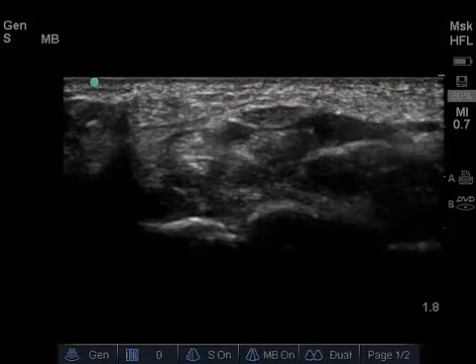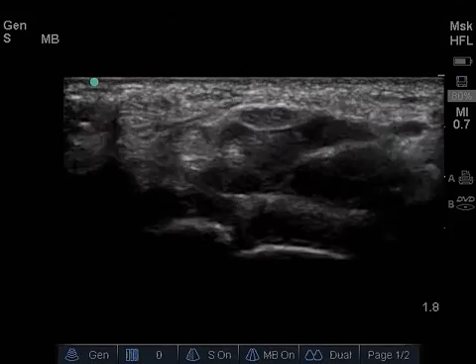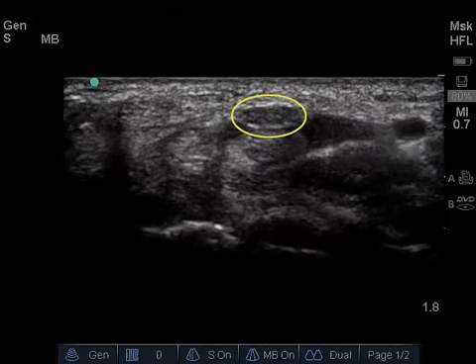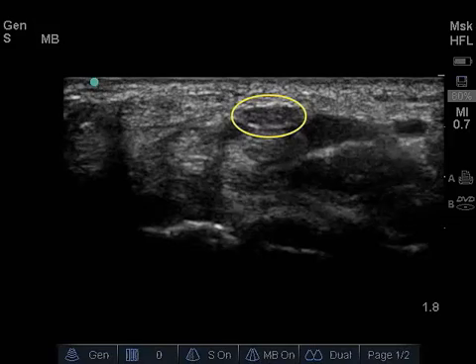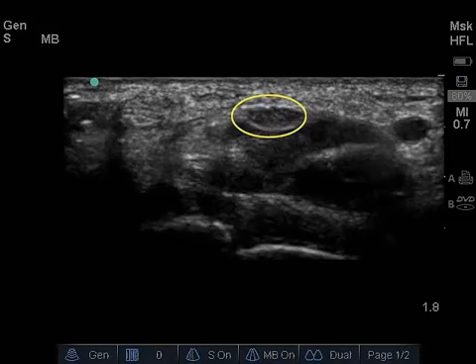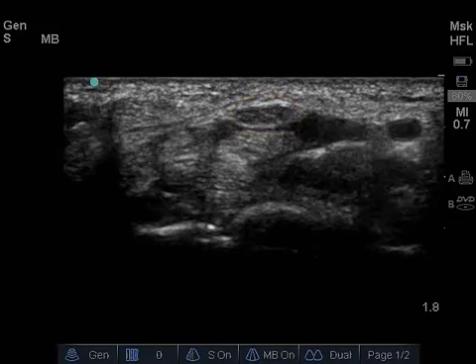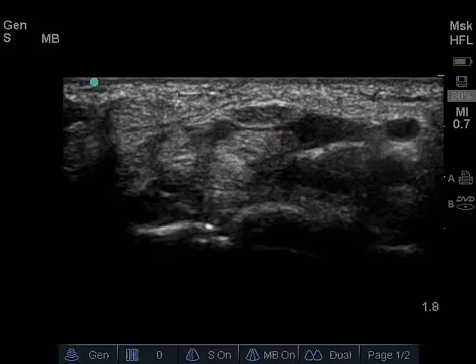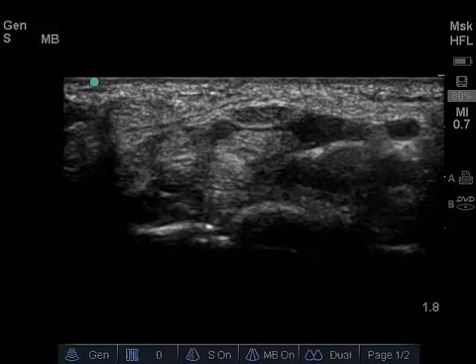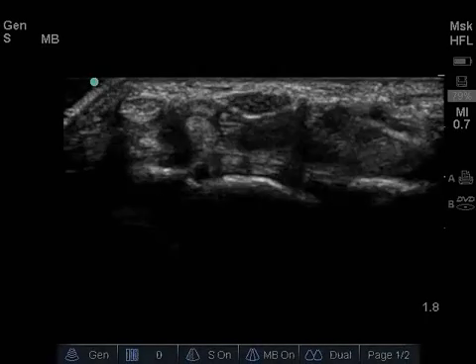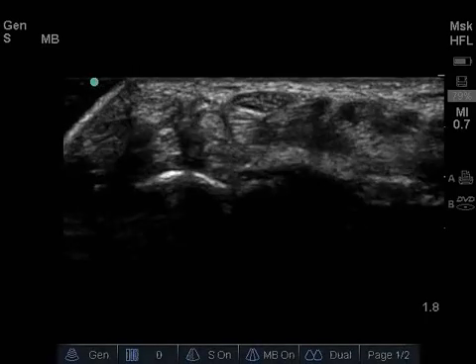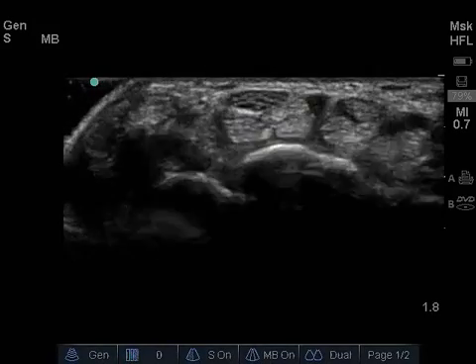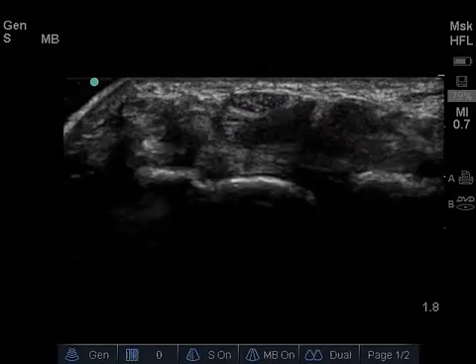In this view, the normal median nerve can be recognized as a round or oval structure with the typical honeycomb appearance that results from the mix of hypoechoic nerve fascicles and hyperechoic connective tissue. The surrounding tendons appear relatively hyperechoic and more homogeneous than the median nerve.